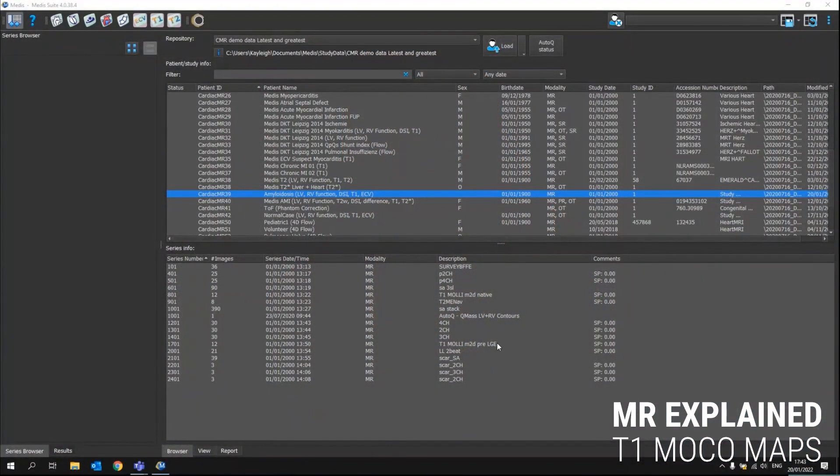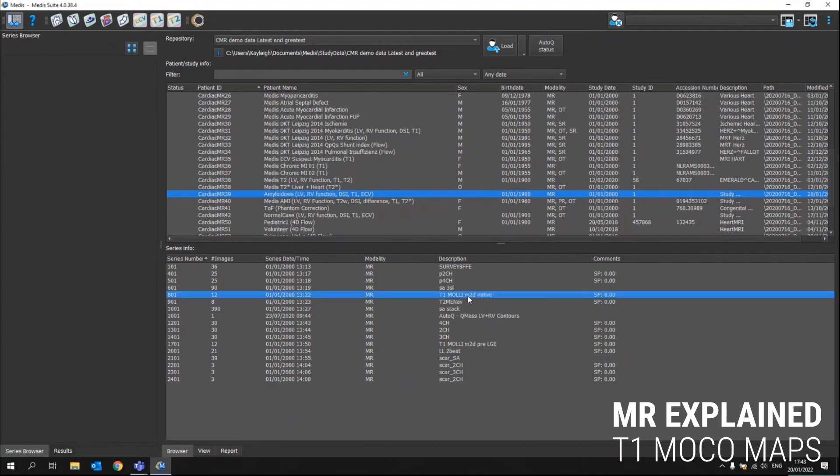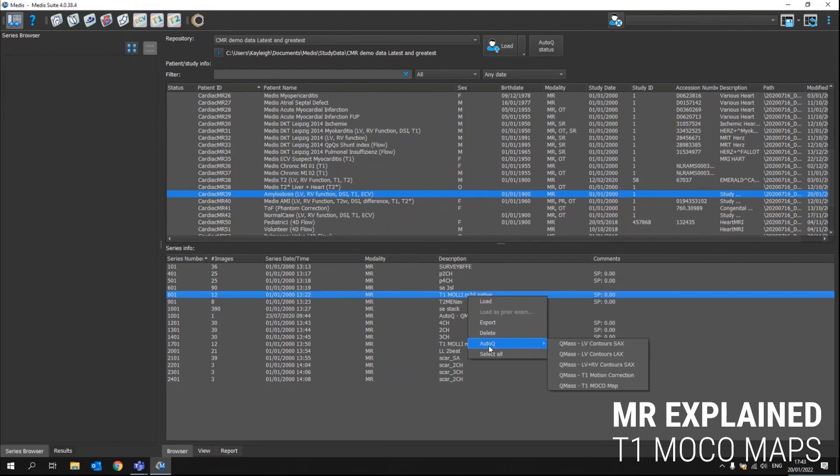So here in our series browser, if we click on the patient, we will see the different series in there. If we click on the T1 and select our AutoQ button, we can go to a new algorithm that has been created, the T1 motion corrected map.